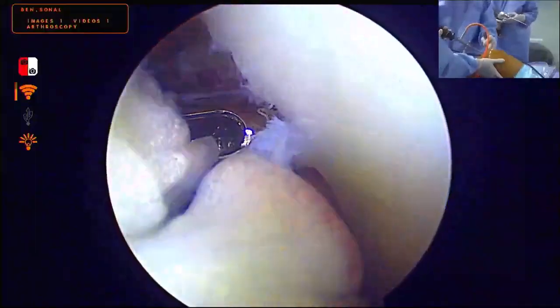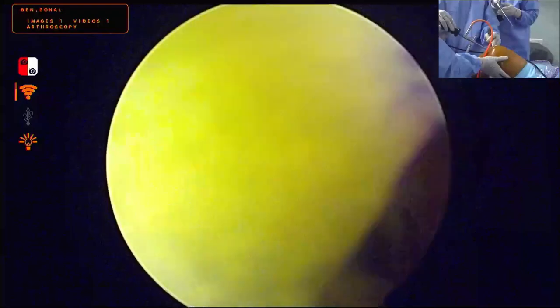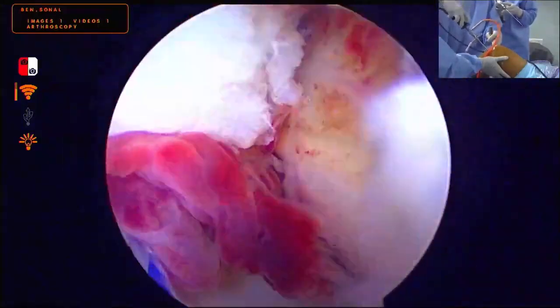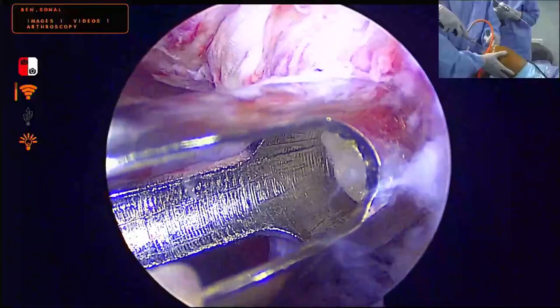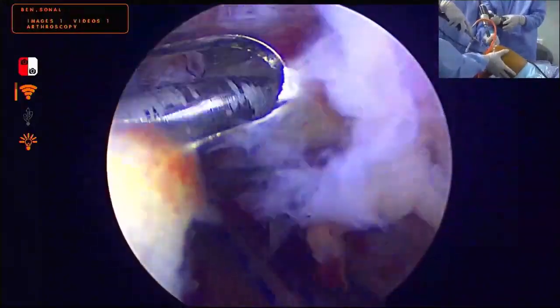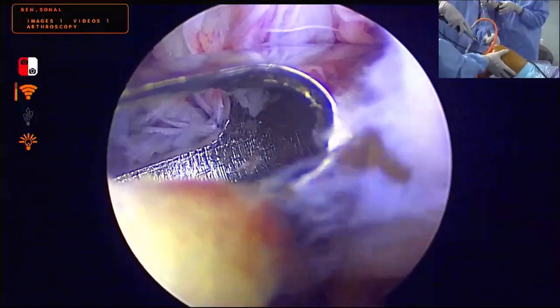Flex it a little bit. Go ahead. Just a minute. Look here. Go ahead. Take it out. Anchor, please.